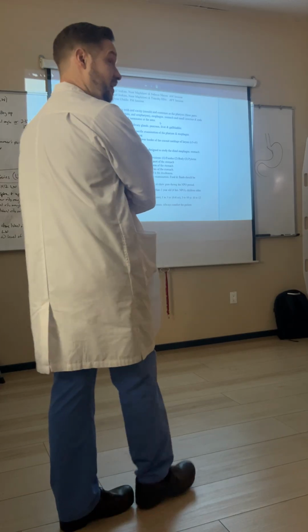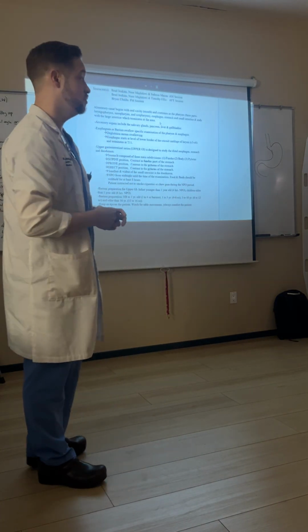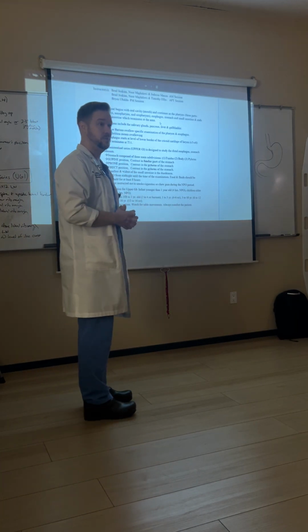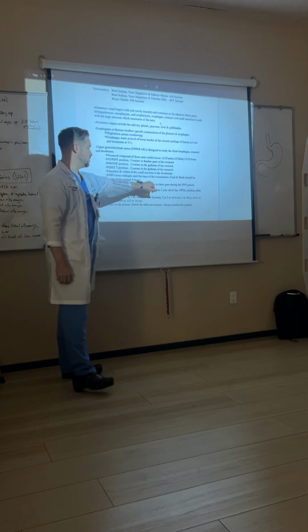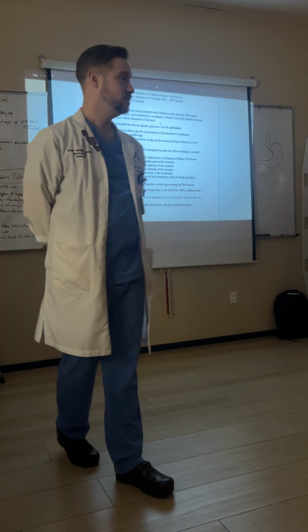It's called a filling defect. So food, if there's food still in the stomach, is going to present a filling defect that could mimic some kind of pathology, okay? And the patient is also instructed not to smoke cigarettes or chew gum prior to the exam.